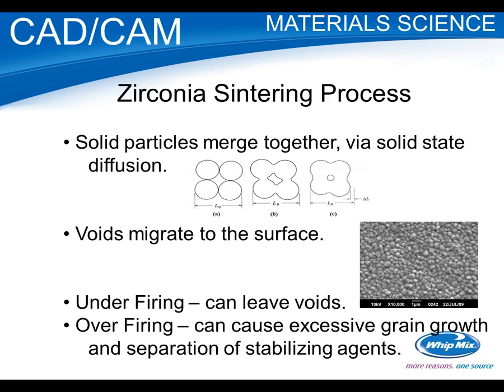If you're not getting the translucency you need, and there have been cases where we've gone through the sintering and we end up with, in a translucent grade, a solid white chiclet, and it's like, whoa, what happened here? Well, it wasn't the firing, and it wasn't necessarily the zirconia. We had a contaminant in the process. So that's the other thing, as you're sintering, make sure you have a clean process, that your furnace is clean, and you're not adding any contaminants.